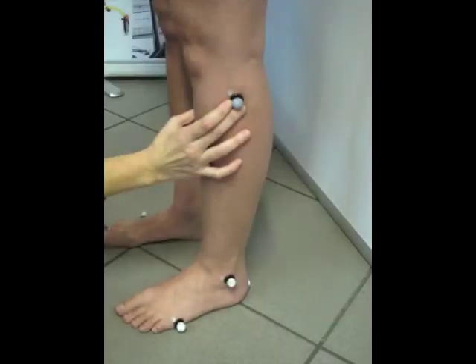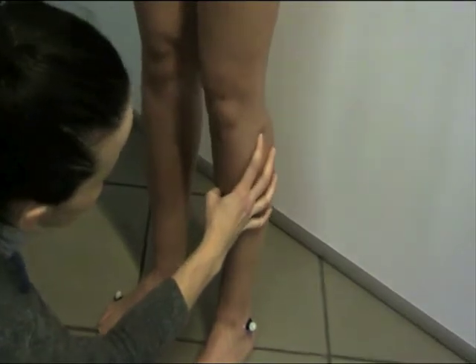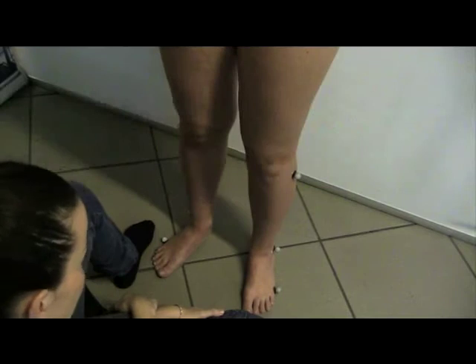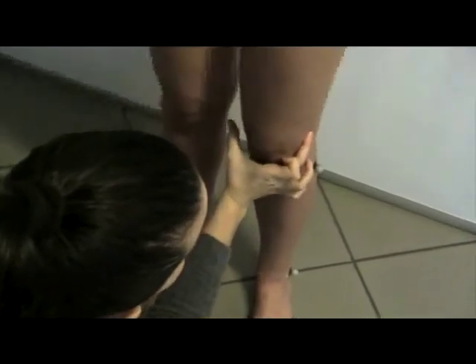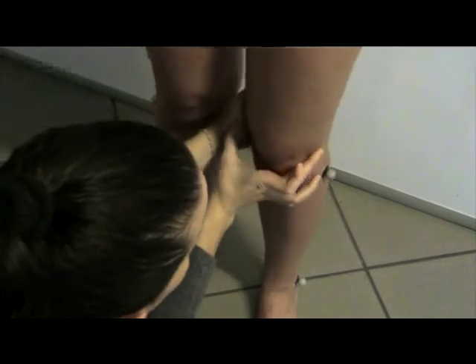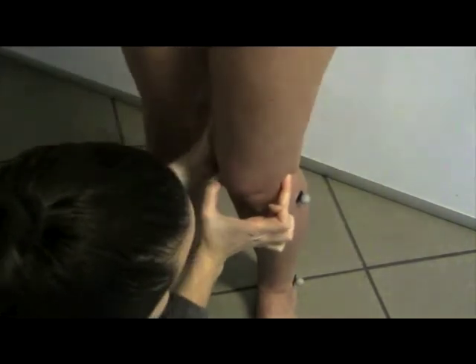Apply one marker on the lateral malleolus, one on the right and one on the left. Now apply one marker on the head of the fibula. For the identification of this landmark, move your hand laterally along the leg, starting from the malleolus, and press lightly on the skin — the first protuberant point that you find is the head of the fibula. Let's go now to apply the marker on the lateral femur epicondyle. I suggest grabbing the knee and placing the third finger of your hand on the lateral epicondyle and the first finger on the medial epicondyle. Ask the patient to move the knee slowly in flexion and extension, and adjust the position of your fingers until you can detect the movement of the bone. Stop the knee in the mid-flex position and apply the marker on the epicondyle.